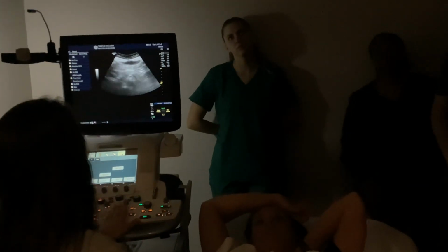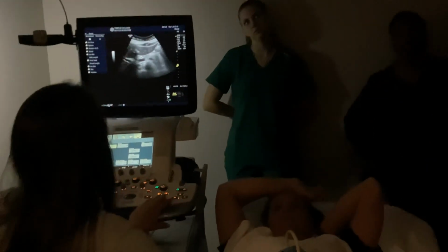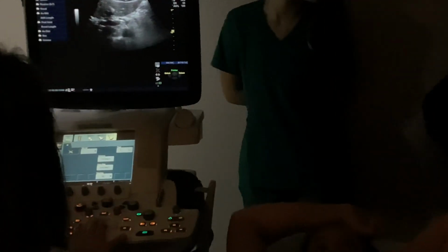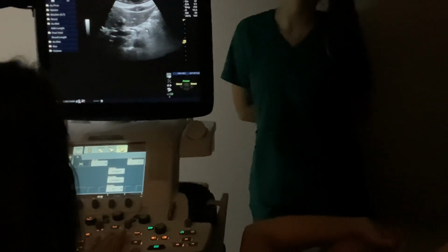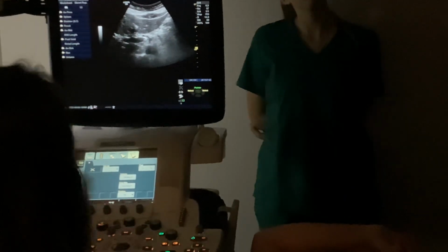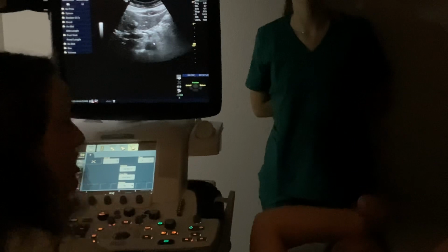There it is. There's the trunk. Okay, breathe. All right, so here is for mid, the celiac trunk. See it here, that seagull sign? It's going to come off the anterior part here, and it's going to branch off like that and look like a little seagull. That's going to tell you you're in your mid.